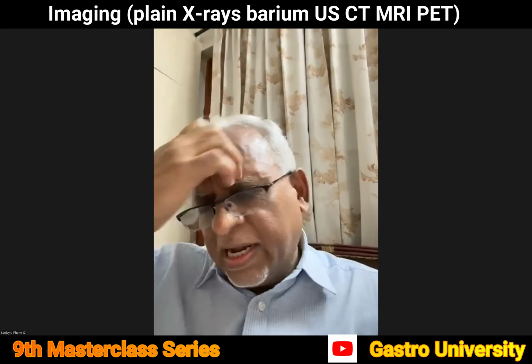We have done studies specifically in extra-chest tuberculosis, especially abdominal tuberculosis and anywhere else. One thing we have found, and it was done under the aegis of IAEA, the International Atomic Energy Agency, and most of the studies were contributed by the Indian participants, including PGI Chandigarh. What we found briefly is, as PET does it from head to toe or mid-thigh, you get all the lesions in tuberculosis.